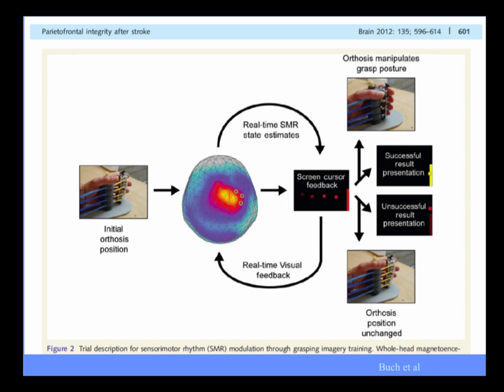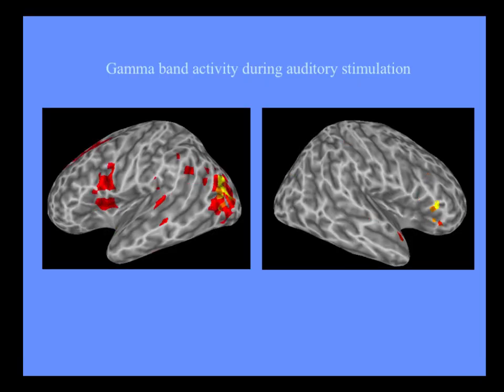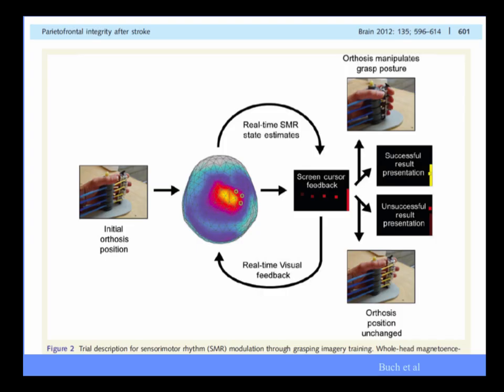The other thing that we can do, which I don't have the slide in here, is that we can record during different neuromodulation techniques. TMS, transcranial magnetic stimulation, we obviously can't do that in our scanner because this is a huge whopping magnetic signal which would blow our SQUIDs totally out of the water. We can do studies before and after TMS, just as we do studies before and after ketamine.